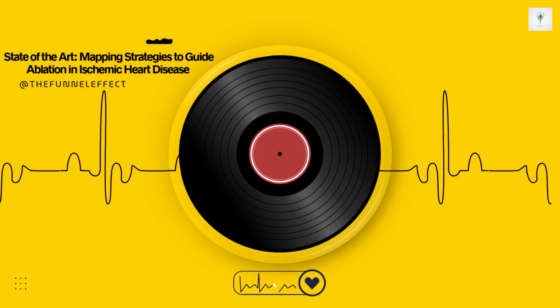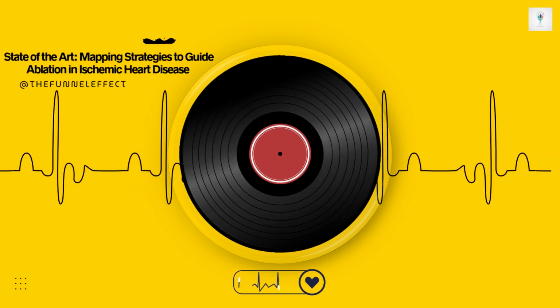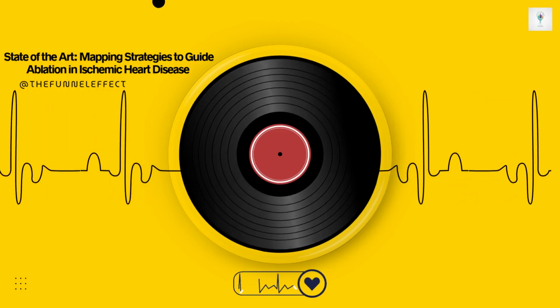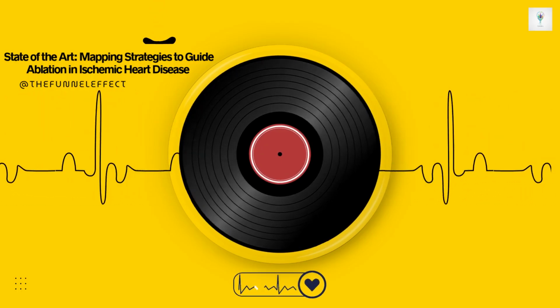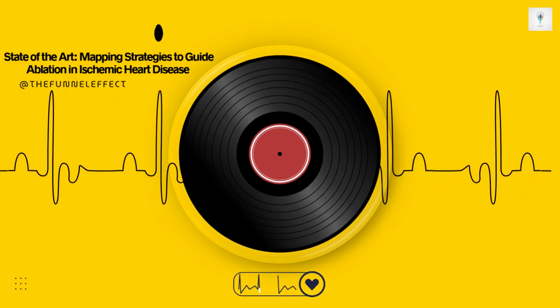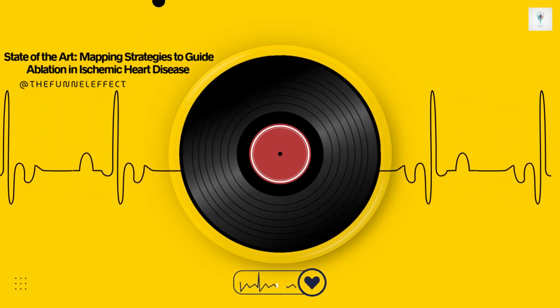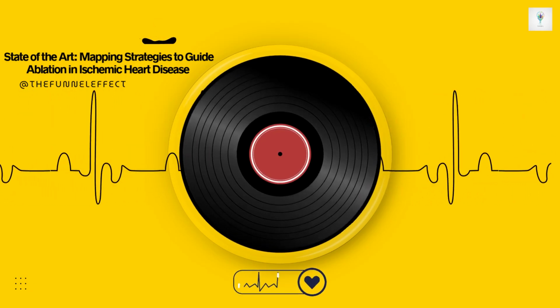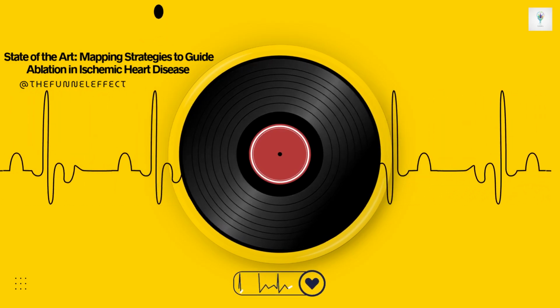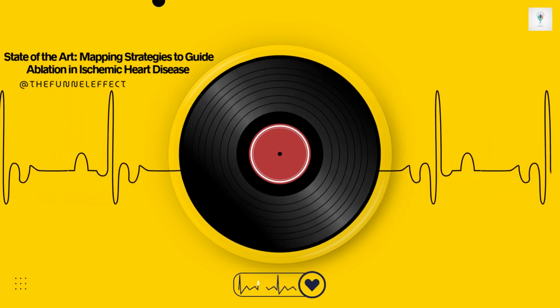This whole uncertainty around the voltage cutoffs and the hidden scar led some groups to try a more aggressive approach: scar homogenization. Instead of meticulously hunting for one tiny path, why not just try to make the whole abnormal area electrically uniform? That's exactly the philosophy, pioneered by groups like Di Biase and others. The idea behind homogenization is, let's target the entire low voltage area, everything below 1.5 millivolts, and maybe even extend that to include any areas with weird-looking electrical signals, regardless of voltage. The goal is basically to create one large, contiguous, non-conducting block of ablated tissue. Turn that heterogeneous, dangerous landscape into a uniform, electrically silent zone where VT simply can't propagate.